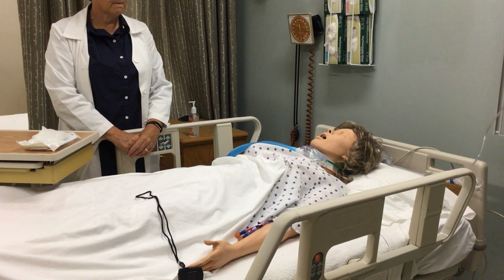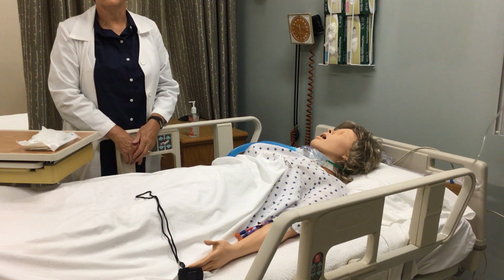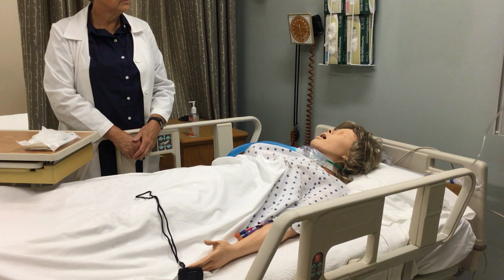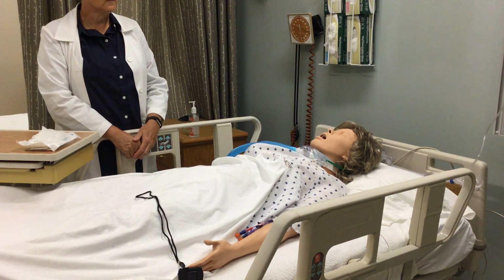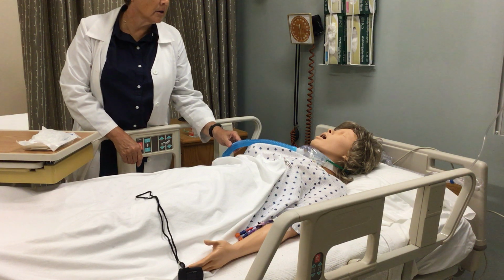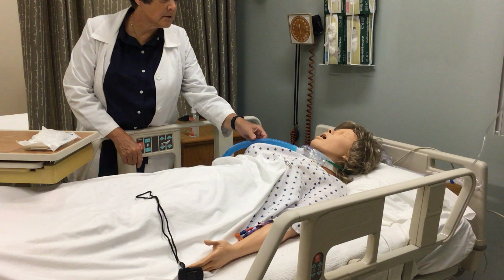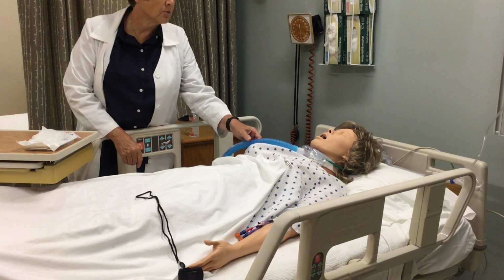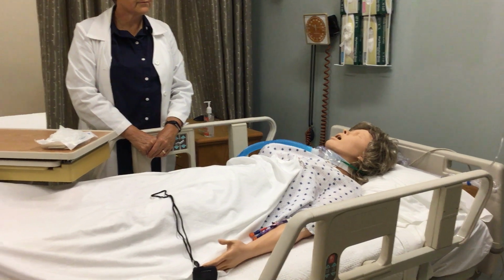Apply pulse oximeter to the patient's finger. Ms. Cruiser has her pulse ox on right now. If oxygen delivery is needed, make sure that the oxygen and humidification delivery sources are in place and that they have been set to the correct levels. Ms. Cruiser currently has what's called a trach collar that delivers humidified oxygen for the patient, and that is her oxygen source.